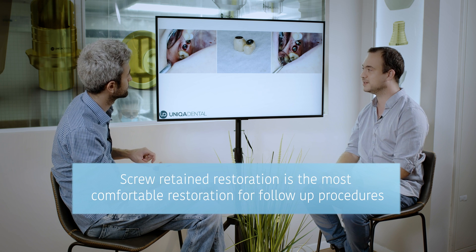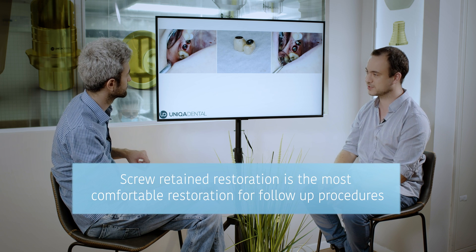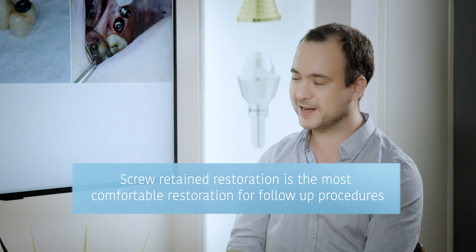You just screwed the crowns out? Yes, just screwed them out. This is the greatest part of screw-retained restorations — when you don't need to break anything, don't need to apply force. You can take everything out and insert it back the same way it was. You have the same occlusion, the same everything. You just take off the crowns, and later when it heals and the gingiva looks fine, you just put them back in. Easy — just screw it out and wait a couple of weeks for the inflammation to resolve.